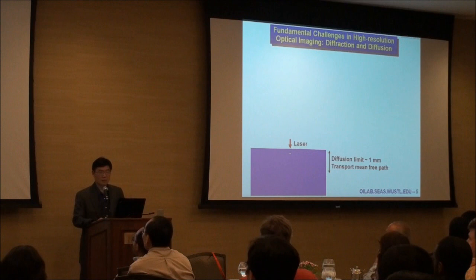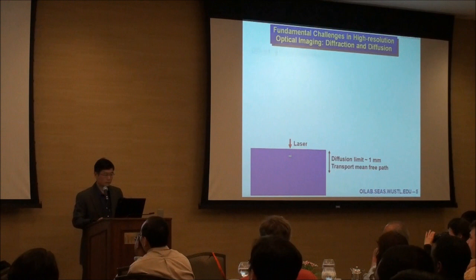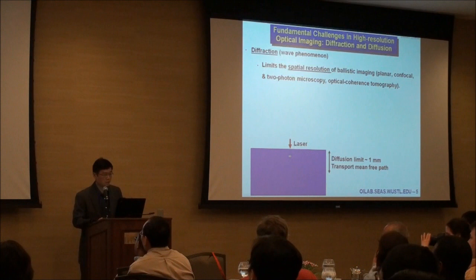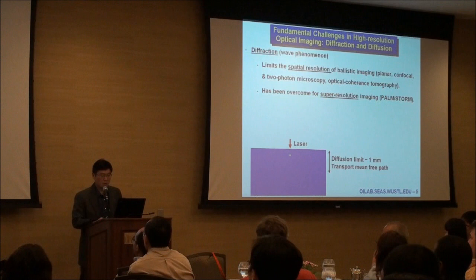Where's the challenge? We face two fundamental challenges in this field: diffraction and diffusion. Diffraction, as a wave phenomenon, limits the spatial resolution of all ballistic imaging modalities you've heard of: wide-field planar imaging, confocal microscopy, two-photon microscopy, and optical coherence tomography. It has been recently overcome for what's called super-resolution imaging through PALM or STORM or STED.